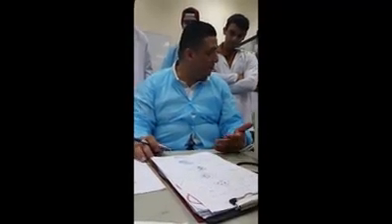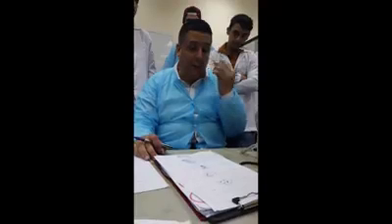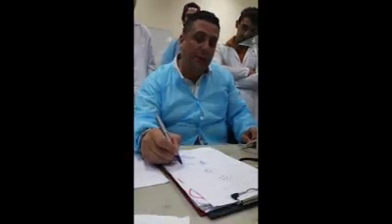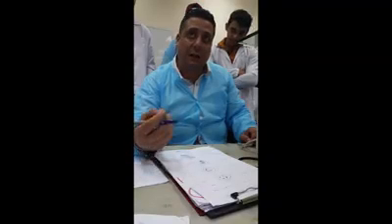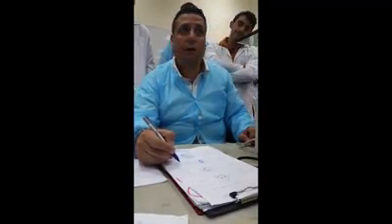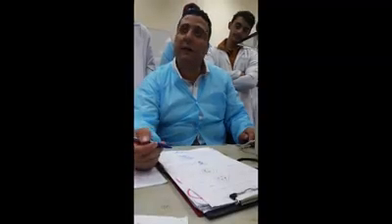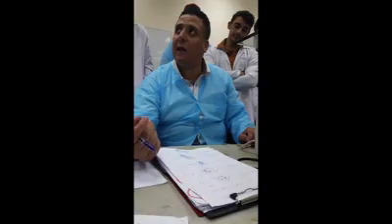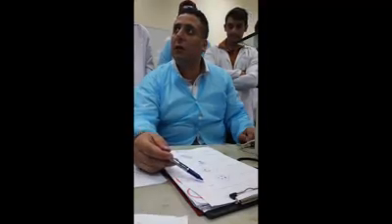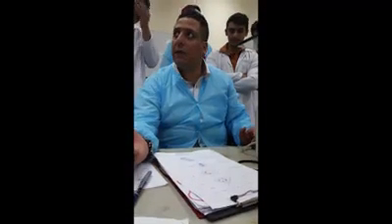We can find them, but this one it's possible to find, but not that easy. Not each sample contains this one. And not each sample you take, you can get basophil, because it's rare, 0.5%. So it's not that easy. Compared with 60, there is a huge difference.